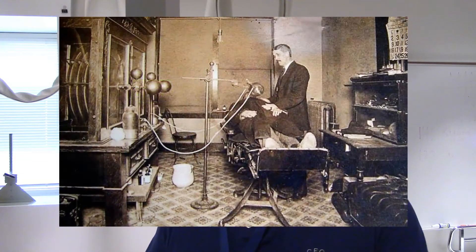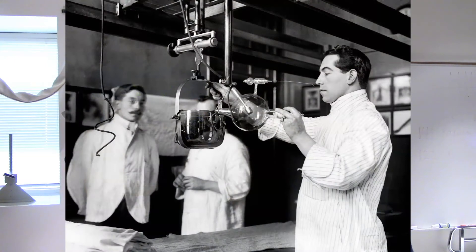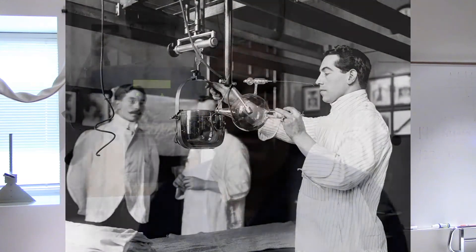What you're looking at are some X-ray tubes that were used back in the day. These are cold cathode tubes. With these old kind of tubes, what you had to have was a rack of tubes in the room. So whenever your patient came in and you gave them the once over and figured out how much milliamperage do I need, well, I'll grab the proper tube, install it, and then I'll make my X-rays.